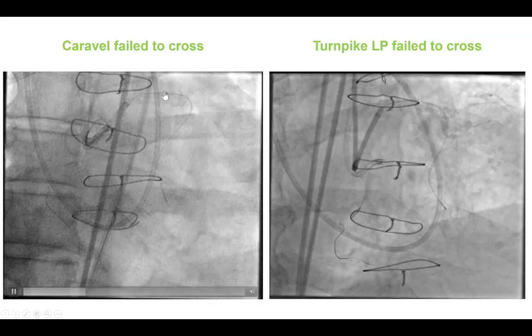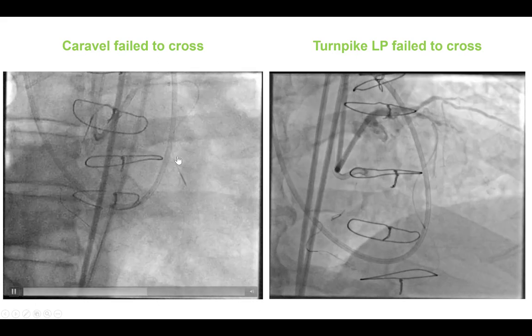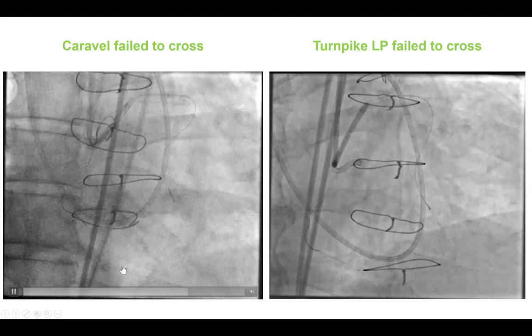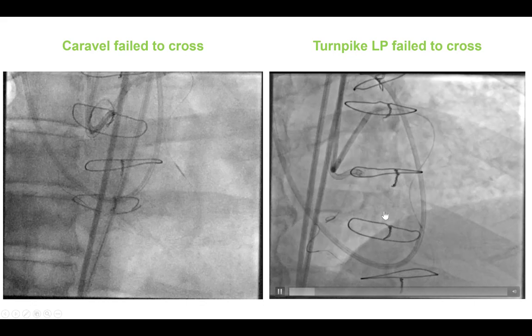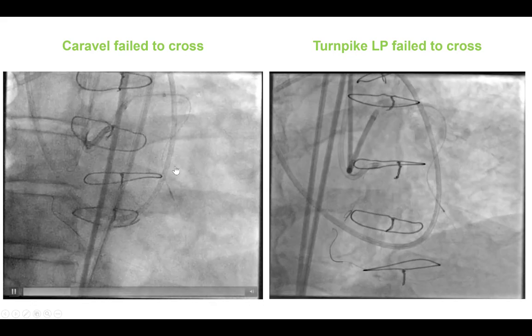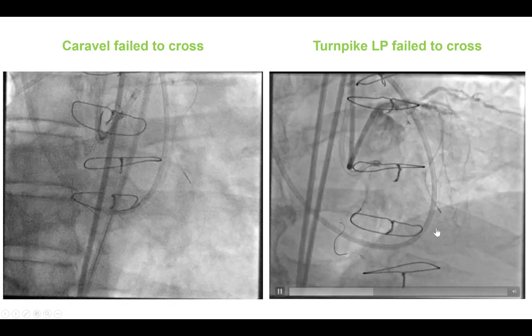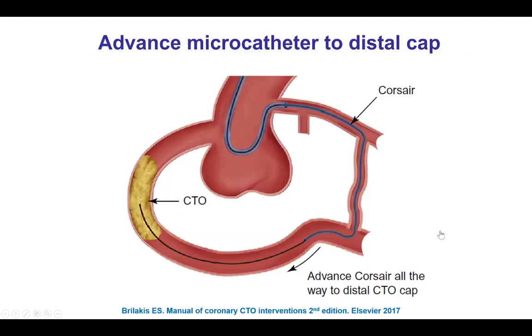Unfortunately, we were unable to advance a Caravel microcatheter over this guidewire, possibly because the septal collaterals were small. We changed to a Turnpike LP, and this also failed to cross. This is one not uncommon problem — the wire goes through the collateral but the microcatheter fails to follow.